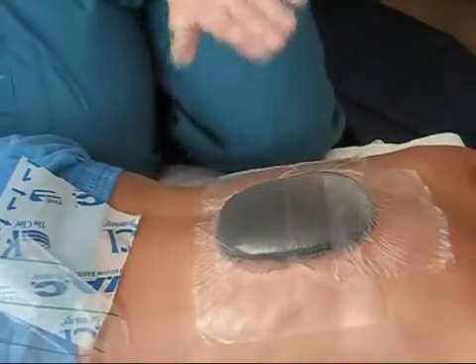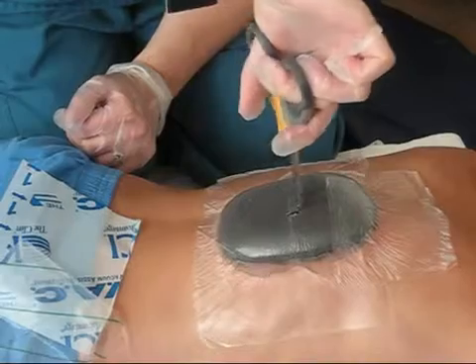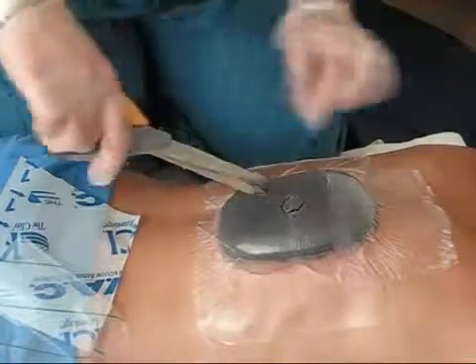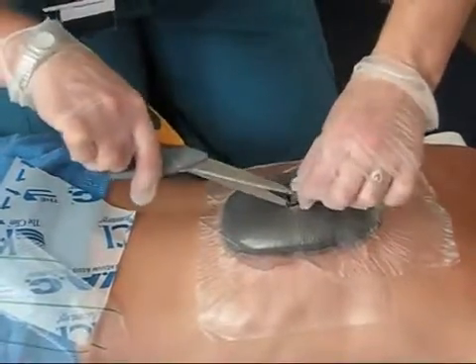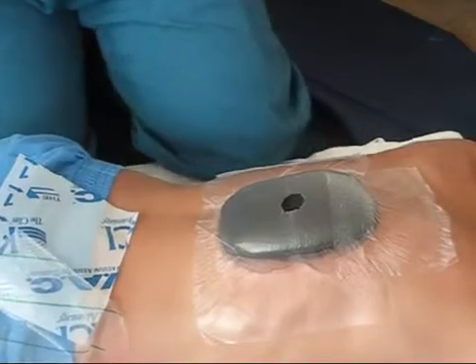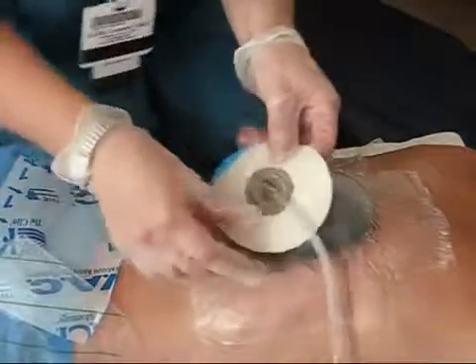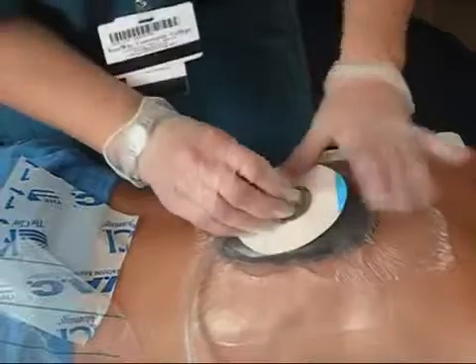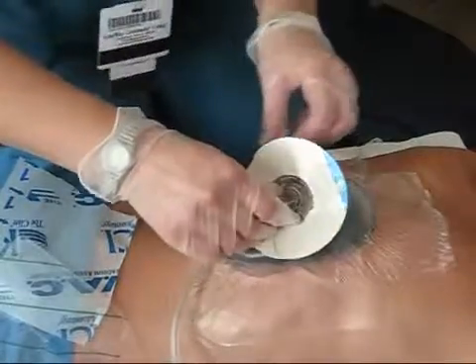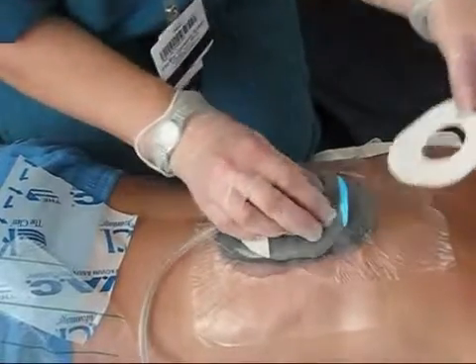Okay, once you've got a good seal on it, you're going to want to cut a hole for the wound vac to be placed on. Depending on the size of the wound, you might need more than one tube, more than one vacuum tube. Then take the tube and place it. You probably want this to come out of his, down the bottom of his shirt or gown. So have it pointing down. Place that right over the hole so it lines up, so it creates a good suction.